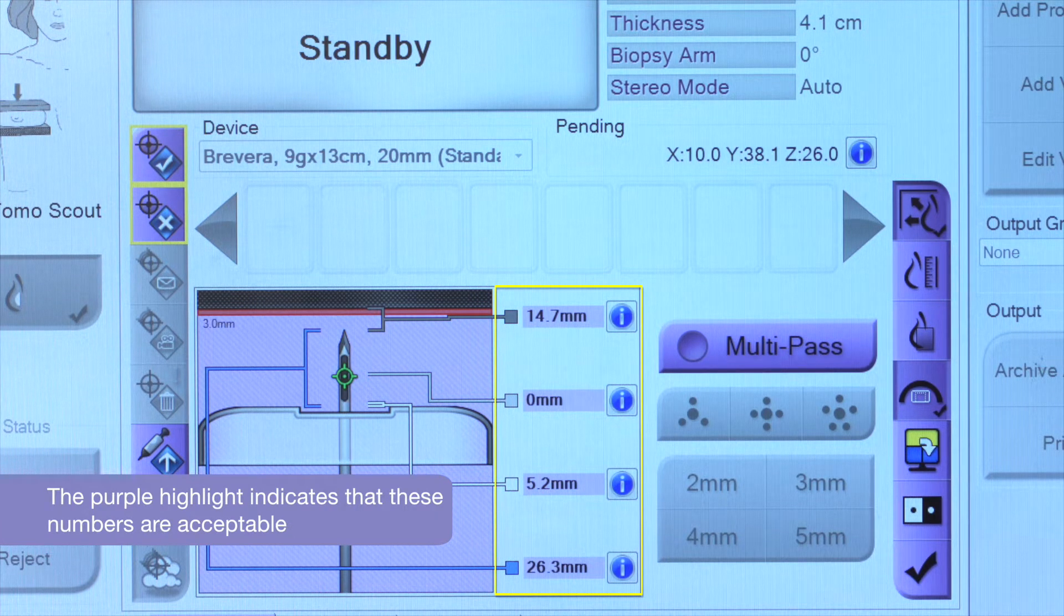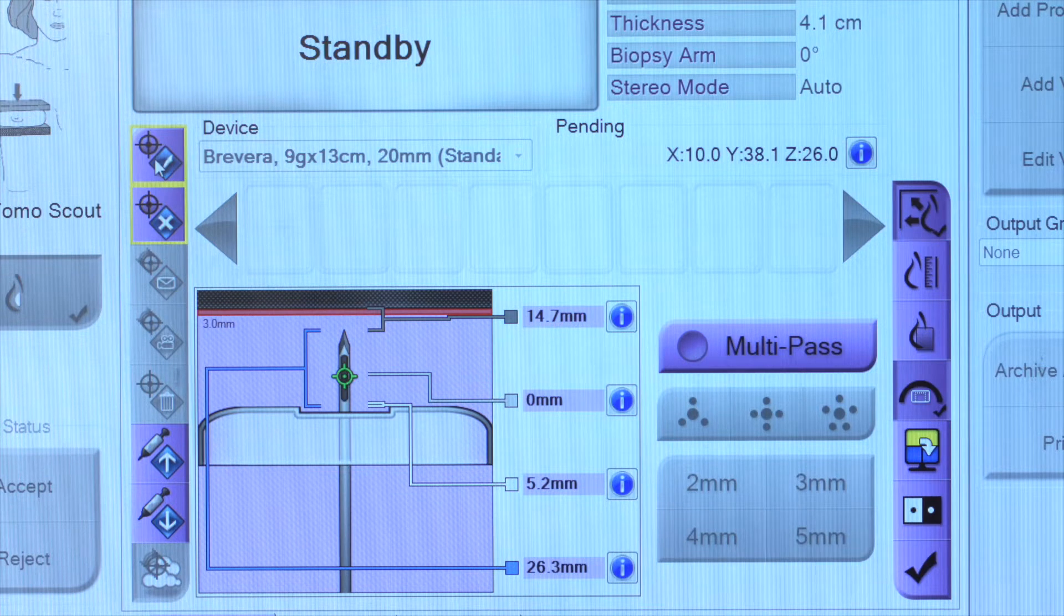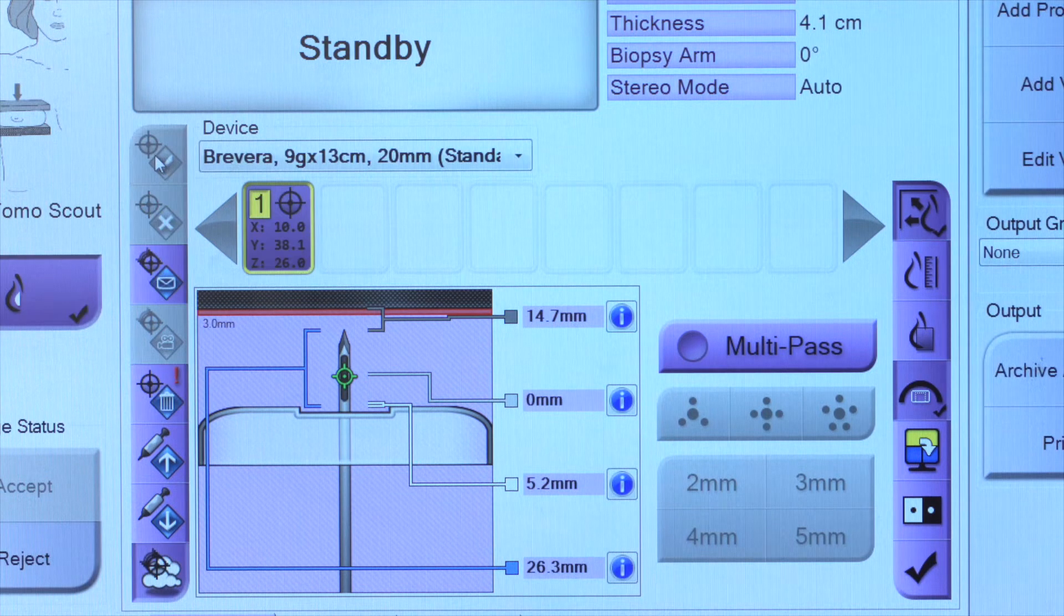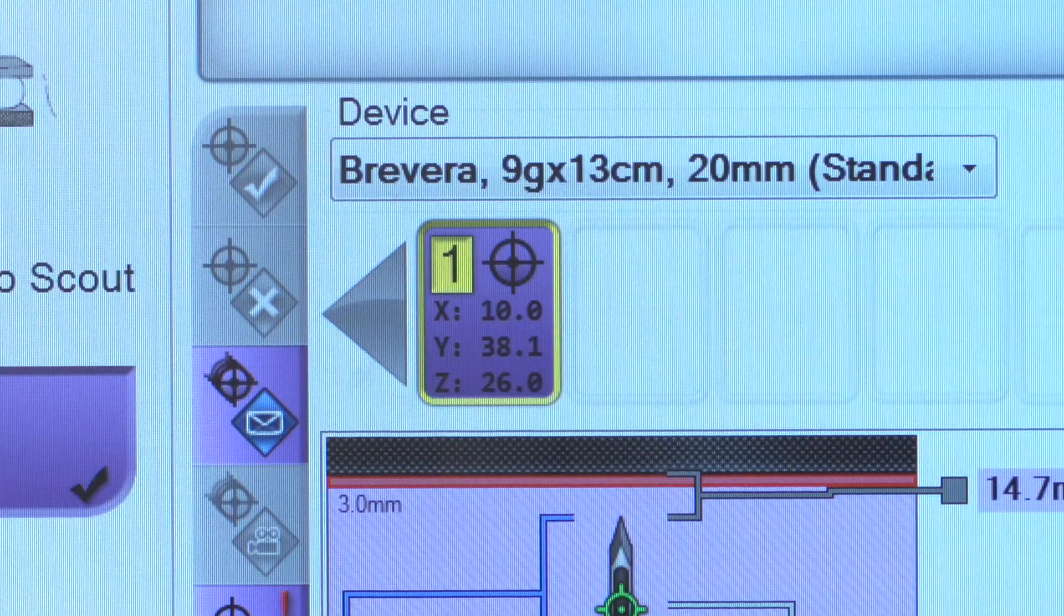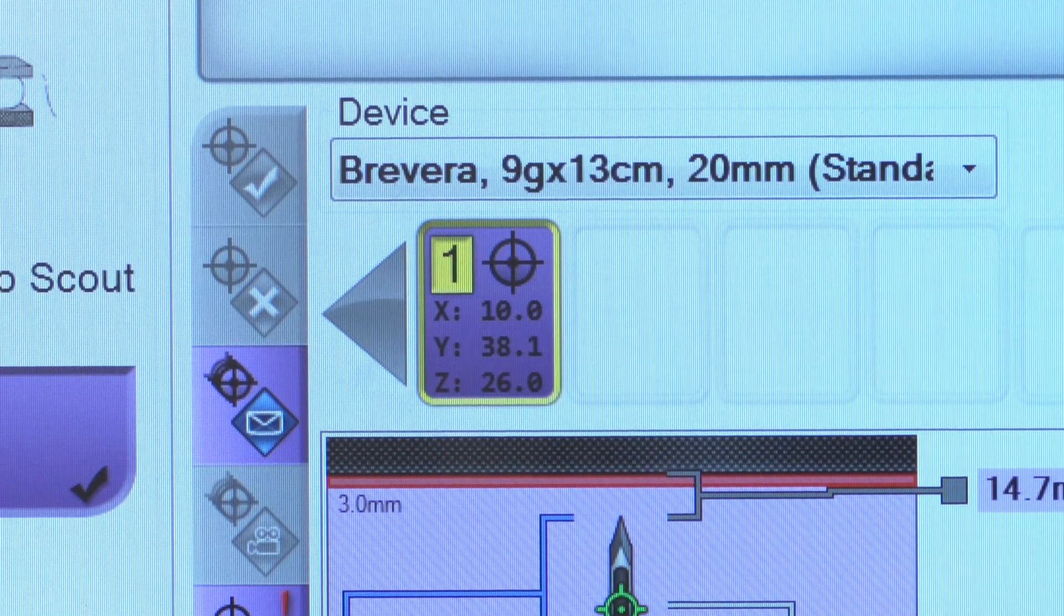Once the physician confirms that the target is viable, they will transmit the coordinates to the biopsy control module, or BCM, on the table. Once transmitted, the target numbers and needle selection on the AWS should match with the BCM.